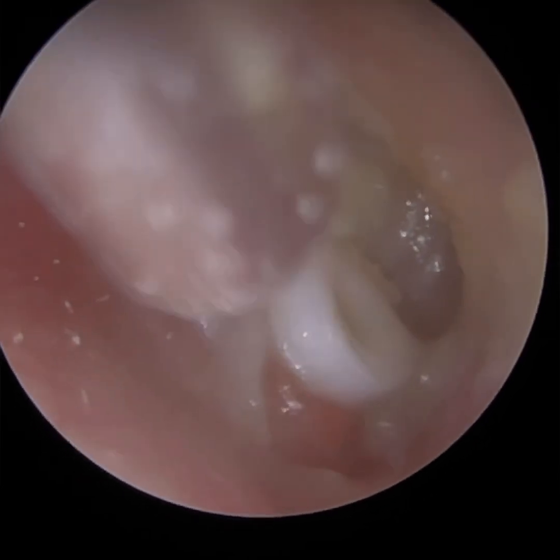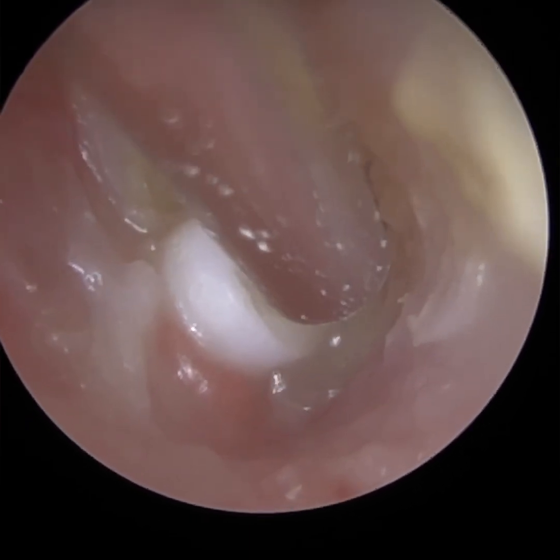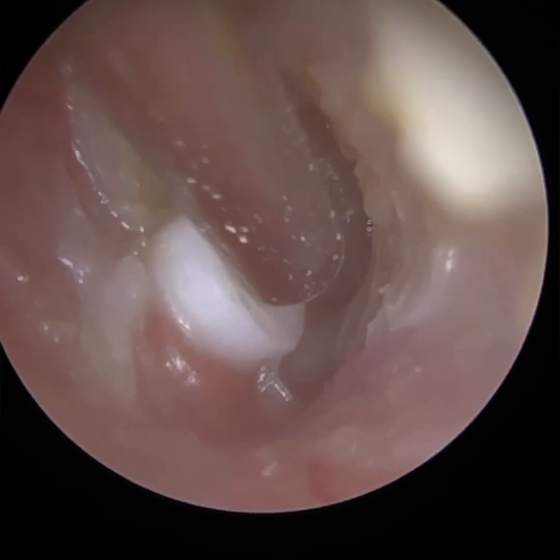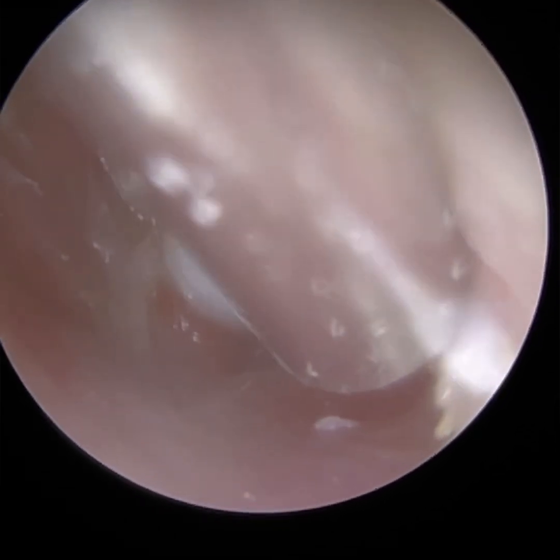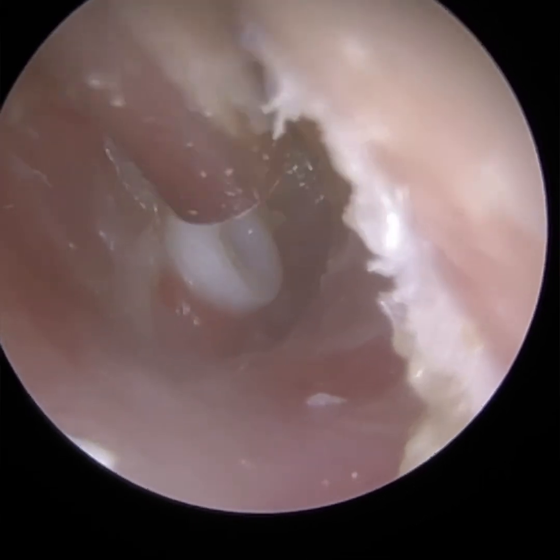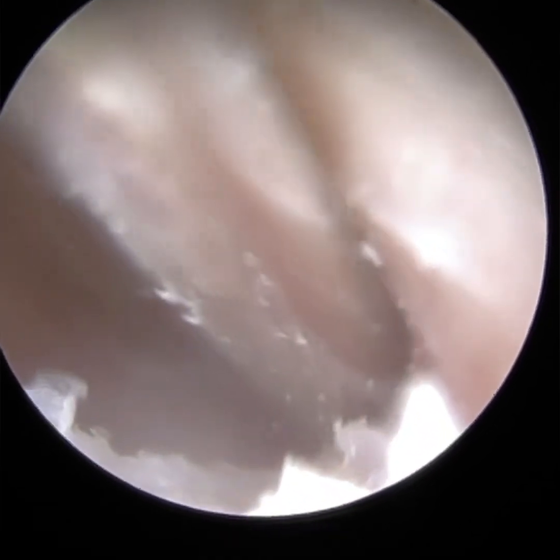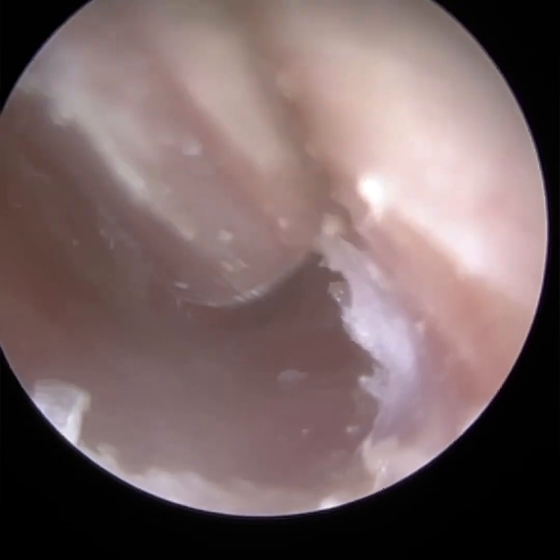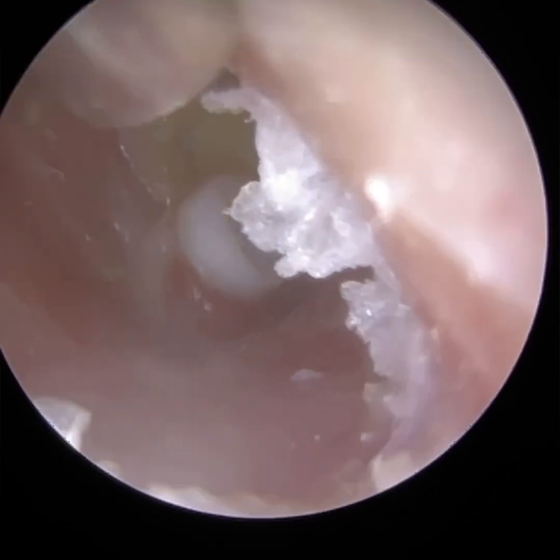And typical hallmarks with acute otitis media is inflammation. So things can be quite red. We can also call that erythema. You get a bulging of the eardrum. Now you can see where the grommet is. To the left of it, there's some granulation tissue there, which is inflammatory tissue. And you normally experience that when there's trauma and the ears are healing. But that part of the eardrum in particular is bulging. And the giveaway sign is the purulent discharge.